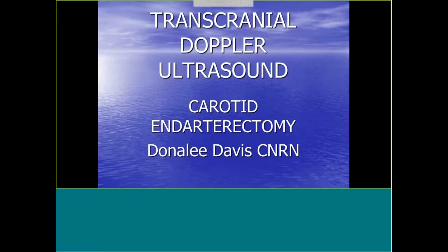Okay. I'm going to talk today about transcranial Doppler in the OR setting, specifically for carotid endarterectomy. During the talk, I'm going to be using the oscillate simulator. It's a hemodynamic simulator that will allow me to demonstrate collateral flow patterns and what will happen in the operating room if you don't have these bridges, so to speak, in place.